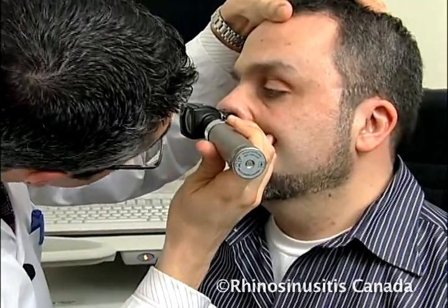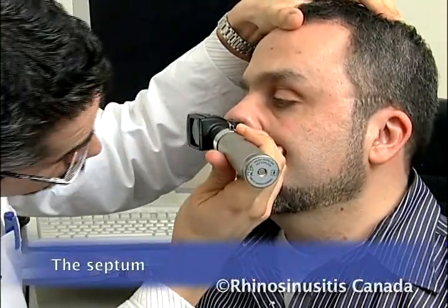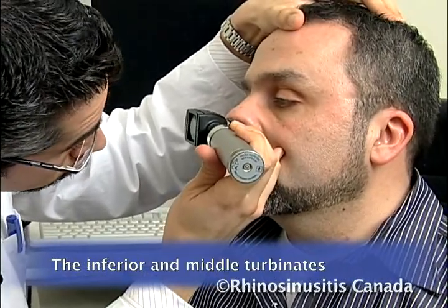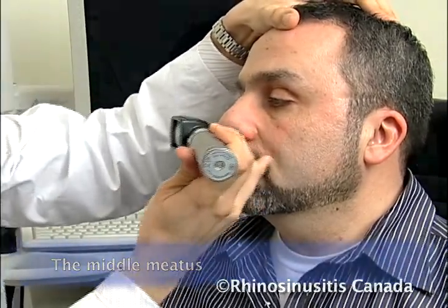Three important areas are examined, including the nasal septum, the inferior and middle turbinate, and the middle meatus. Now let's look at a few anatomical and pathological entities that you may encounter during your examination.